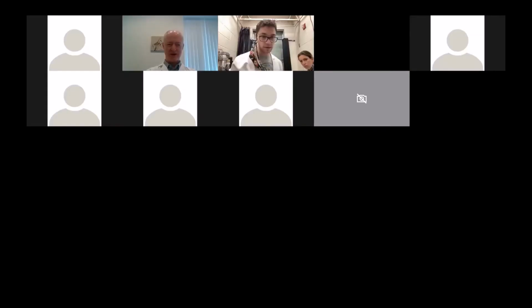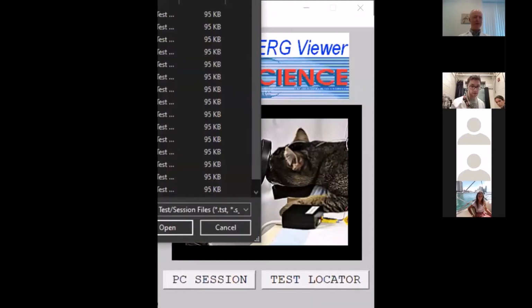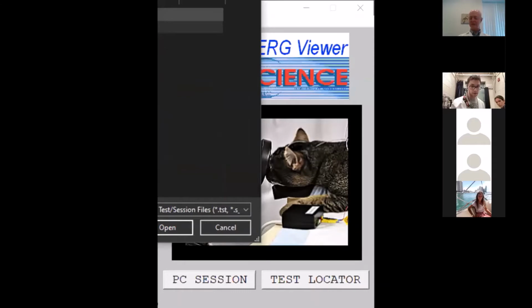Screen sharing stopped as the shared window is closed. Oh, sorry, let me screen share again. Okay, I'll share that screen. I have to do a PC session again. Let me grab some data. And 10. All right, so let's see.